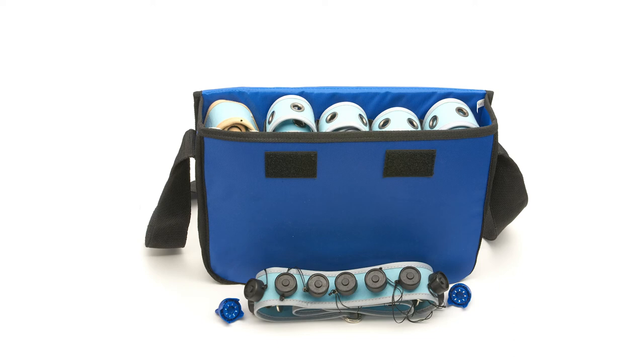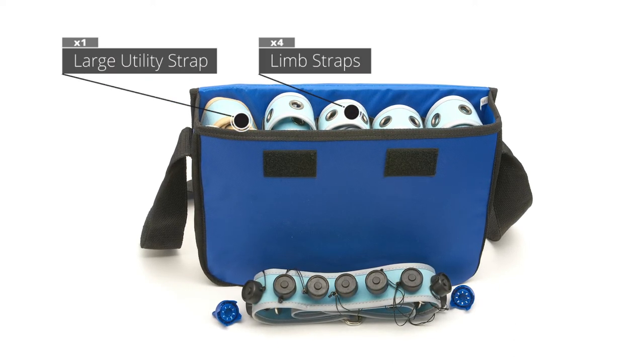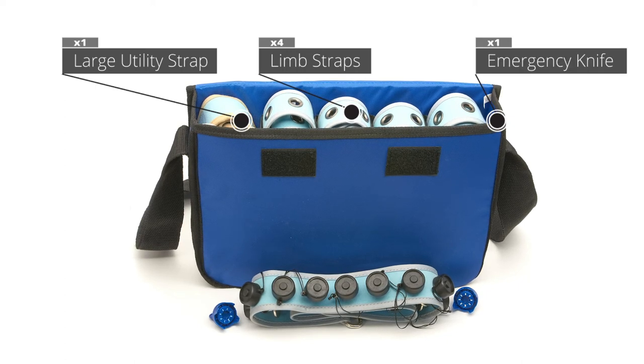Slots under this layer, from left to right, include a large utility strap and four limb straps. On the right side of the bag is a slot that contains the emergency cutting knife.